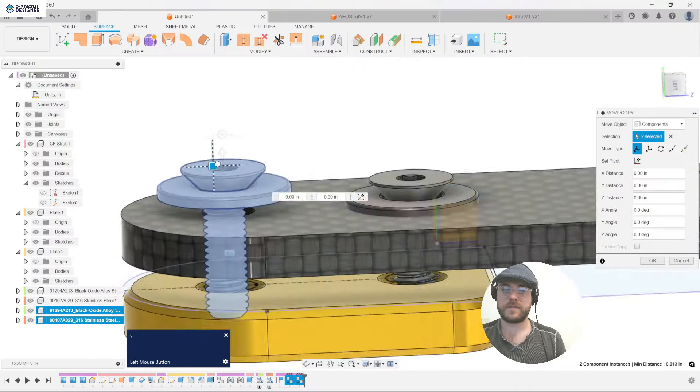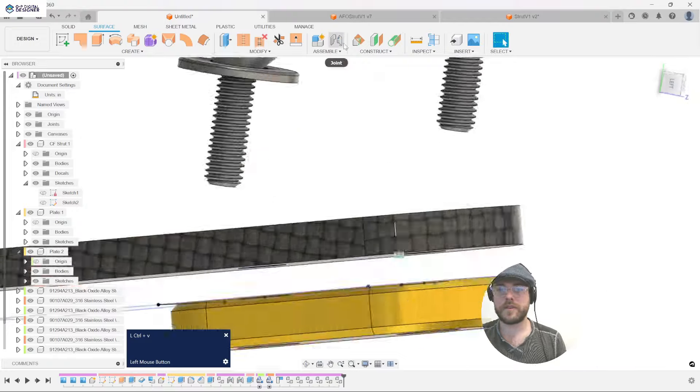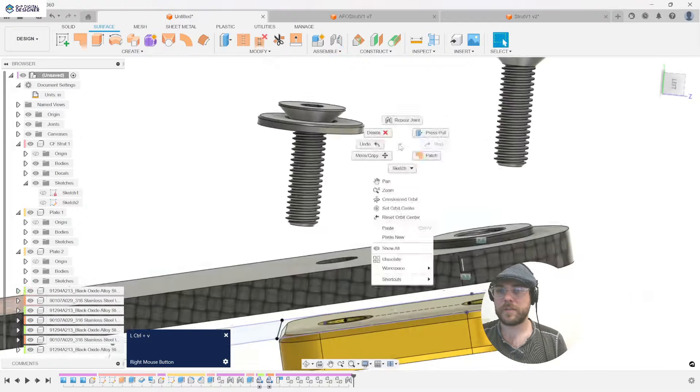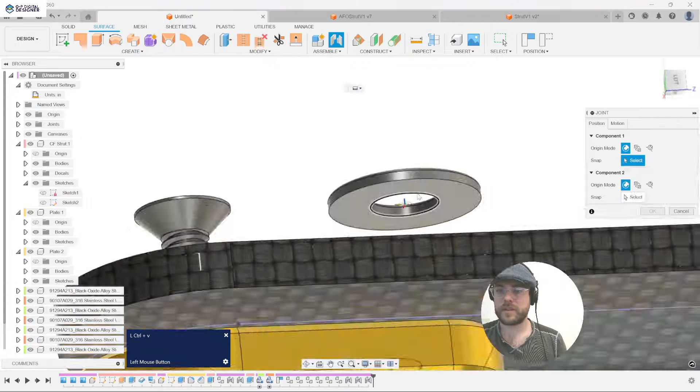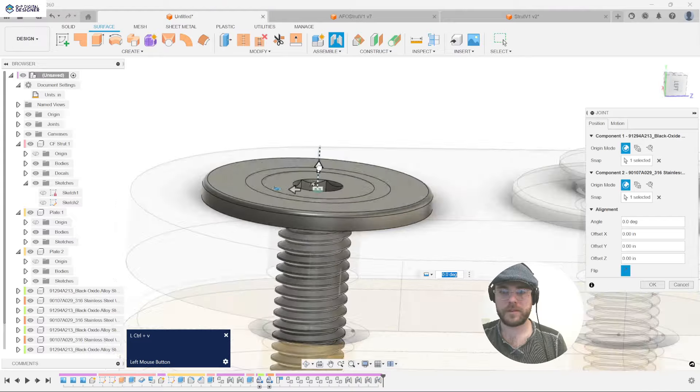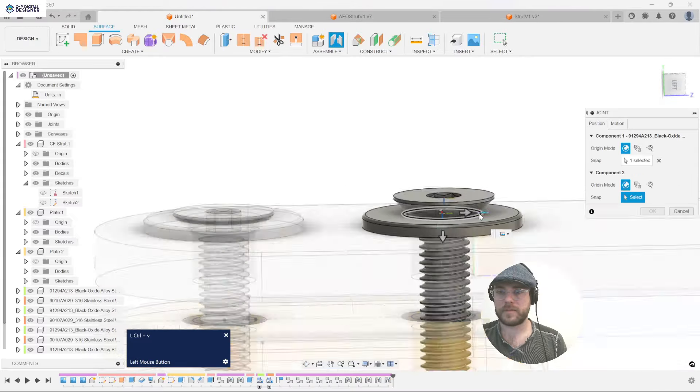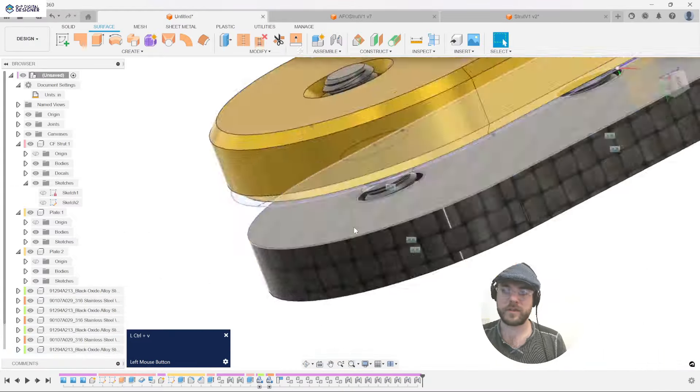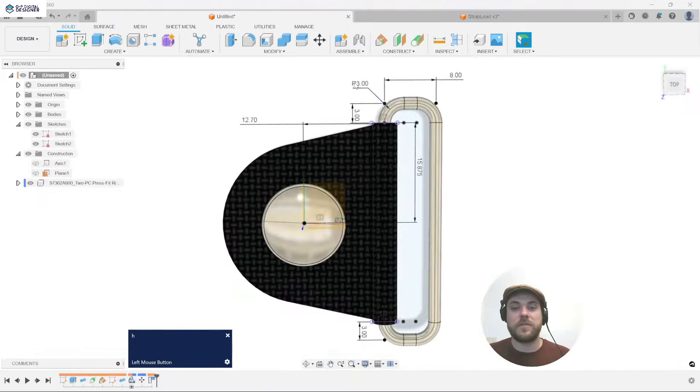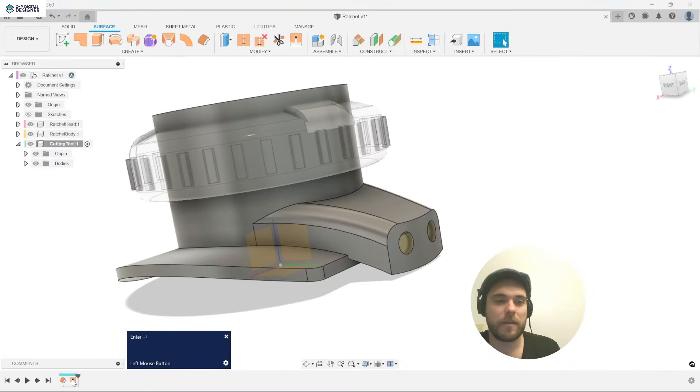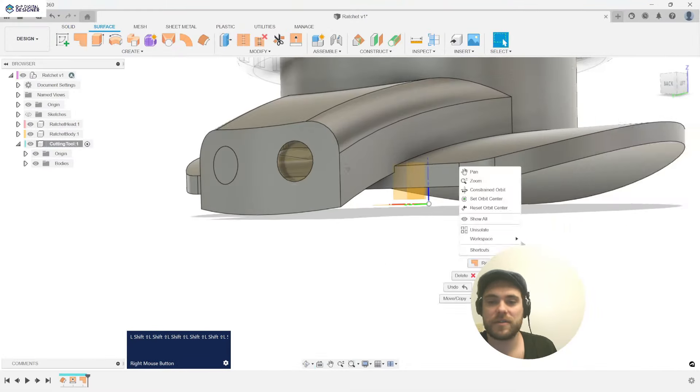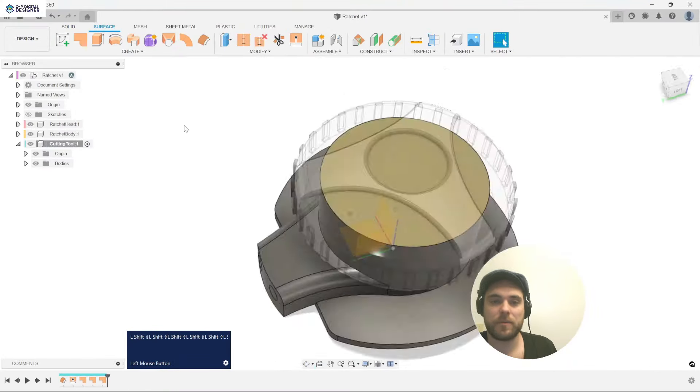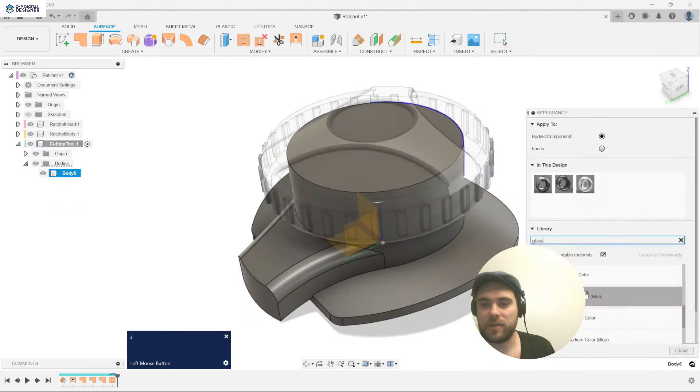We then go straight into Fusion 360 and start building out template files for each of the main components and features that we will want to build into this and every patient case we work on. Things like a Fabtech strut kit or a strap lead, a boa ratchet and their corresponding merge and cut tools for easy repeatability between patients.